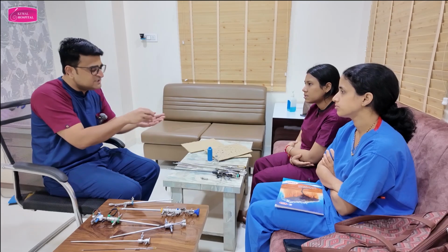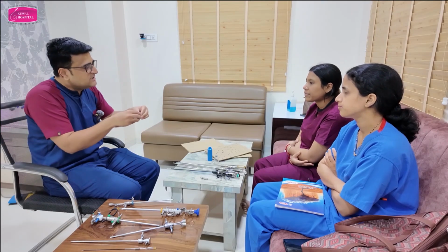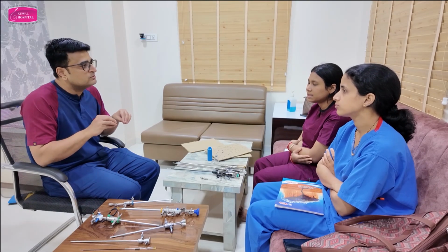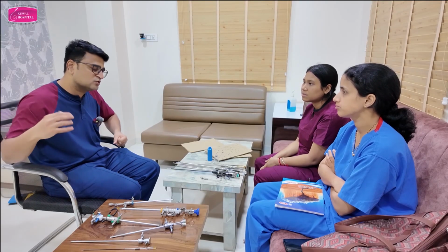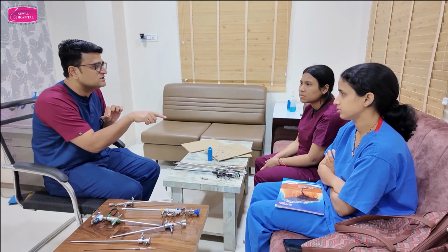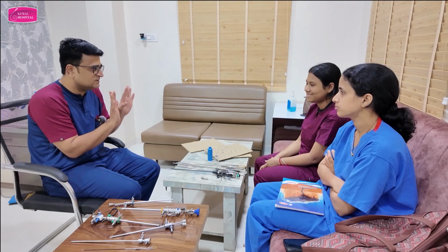If there is no leak, then the 60 will match this 60. But if there is a leak, both pressures will not match. This is a practical point. So what can you do in such scenarios? Increase the pressure, or you can attach the Ellis forceps to the cervix so that it doesn't leak. Sometimes in spite of increasing so much pressure, still you will not get distension. So attach the Ellis forceps to the cervix and then introduce the hysteroscope in the middle. Now clear? Shall I repeat one more time? Is it clear now?